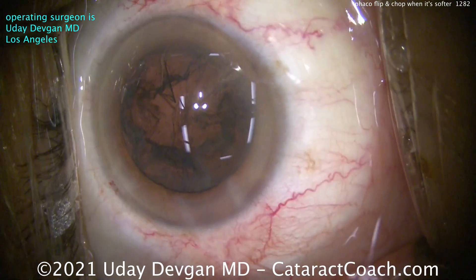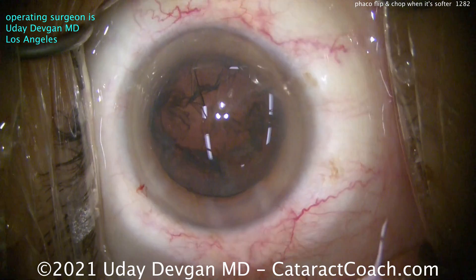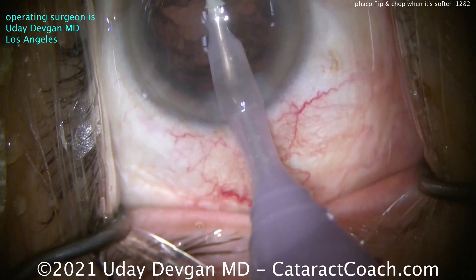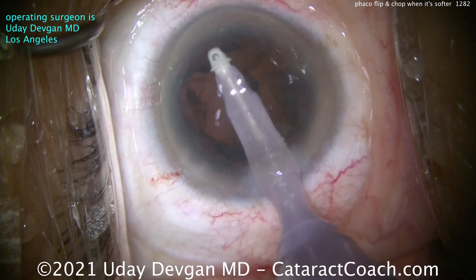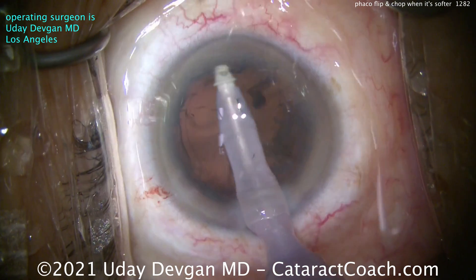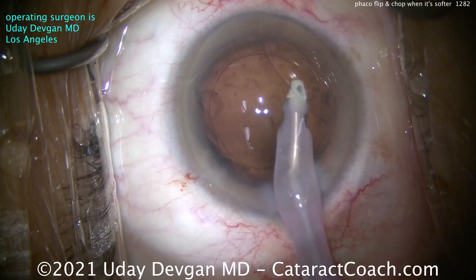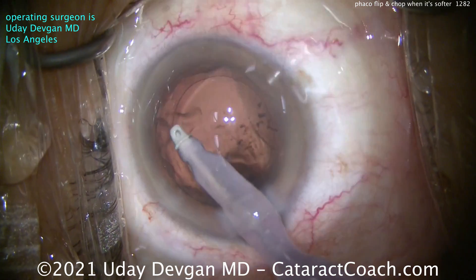Now for cortex removal — adjusting the lighting here to give a better view. You can see the corneal hydration of the incisions; those look pretty good. Now let's clean up the cortex. In a case like this you may have more cortex, so taking our time here, grabbing as much of these sheets as we can. Notice how I pull more circumferential than radial. A lot of novices always pull radial — they grab the periphery and pull it radially. But as you get more advanced, you'll do more circumferential, which makes a lot more sense. You're able to grab big swaths of cortex at a time rather than little tiny strips one by one.